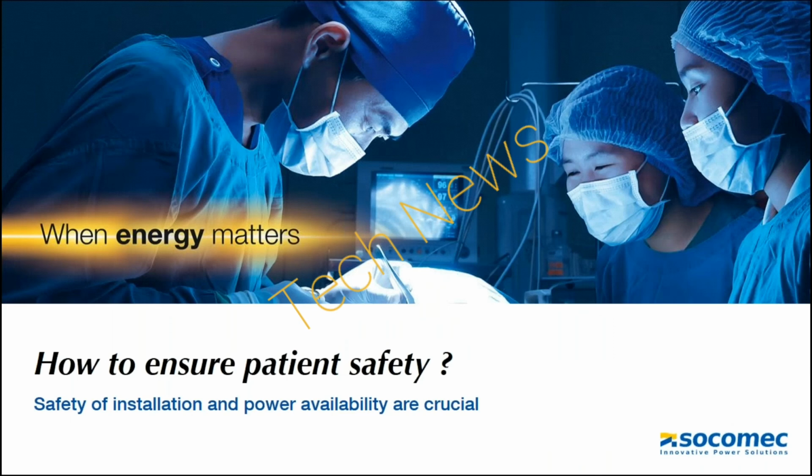Okay, so two main aspects we need to focus on in order to ensure safety of patients. The first is safety and protection against electrical shock. And secondly, it is the continuity of the power supply. In the critical medical locations, there are several risks that need to be mitigated. These risks can be due to the heart muscle being highly sensitive to electric currents, or the insertion of catheters into the body may reduce the electrical resistance of our skin.